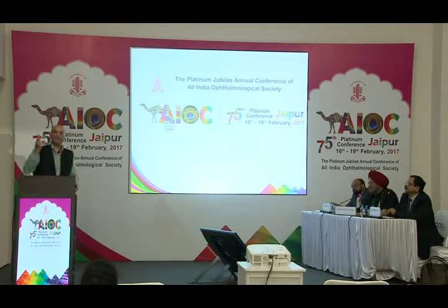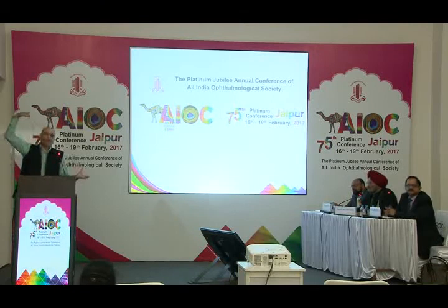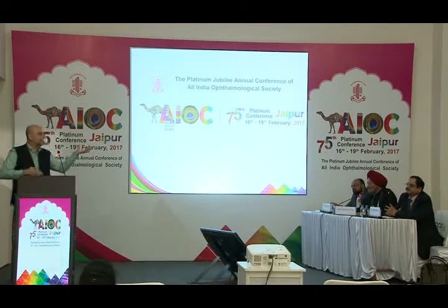There's one trick which I do. People have reported, especially using a hydrophilic lens, that they get an anterior cataract because the lens rubs on the surface. Two simple points. Make sure you go parallel to the plane of the iris. Don't push it like you push in an IOL. That's the biggest mistake we as cataract surgeons do. We go vertically towards the pole of the capsular bag. Don't do that. Aim at the equator on the opposite side.